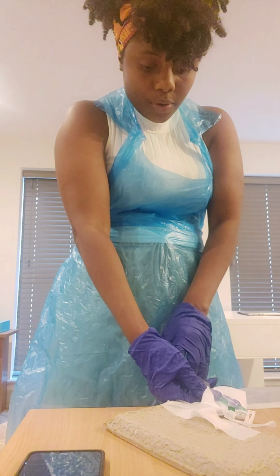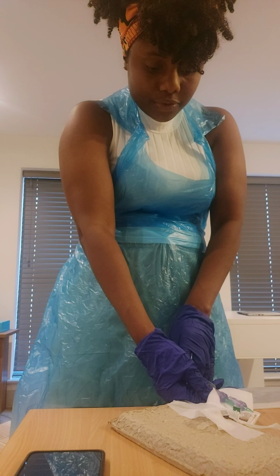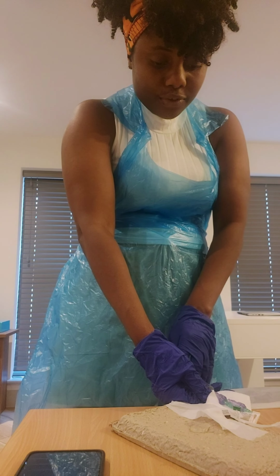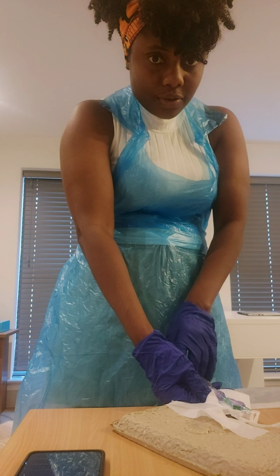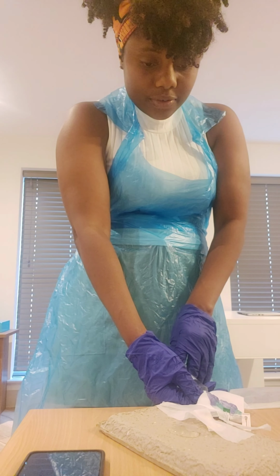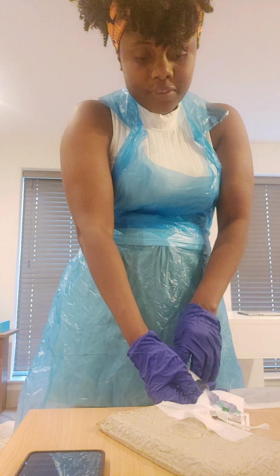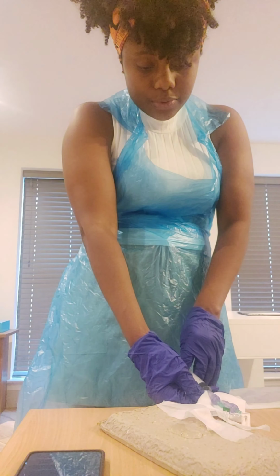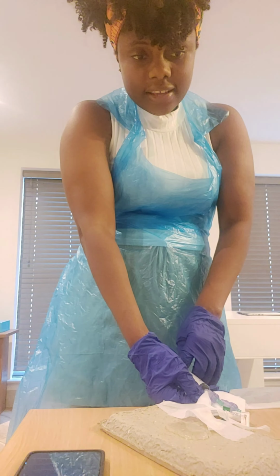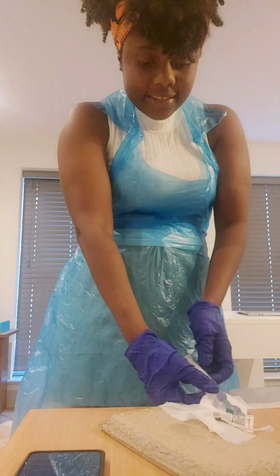So I'm going to push, stop, push, stop. Annie, do you feel any pain? No. Okay, so push, stop, push, stop. Annie, do you feel any pain? No. Okay, push, stop, push, stop. Any discomfort? No. Okay, so push, stop, push, stop. Annie, do you feel any pain around the site? No. Okay, so we are finally done.